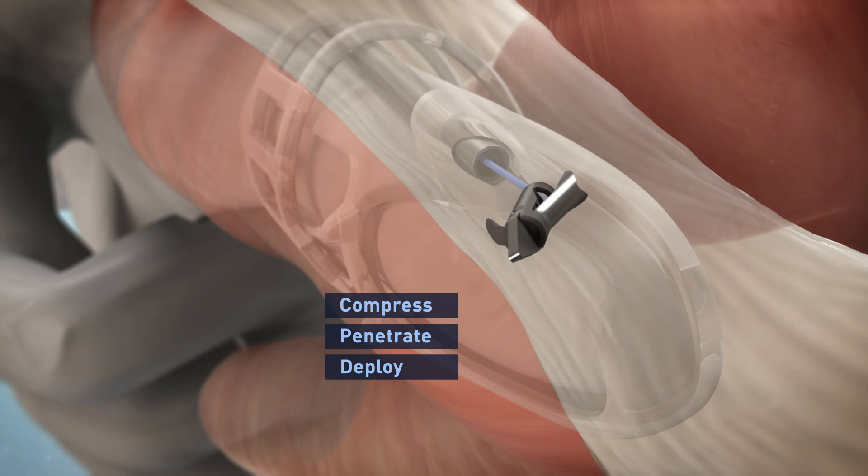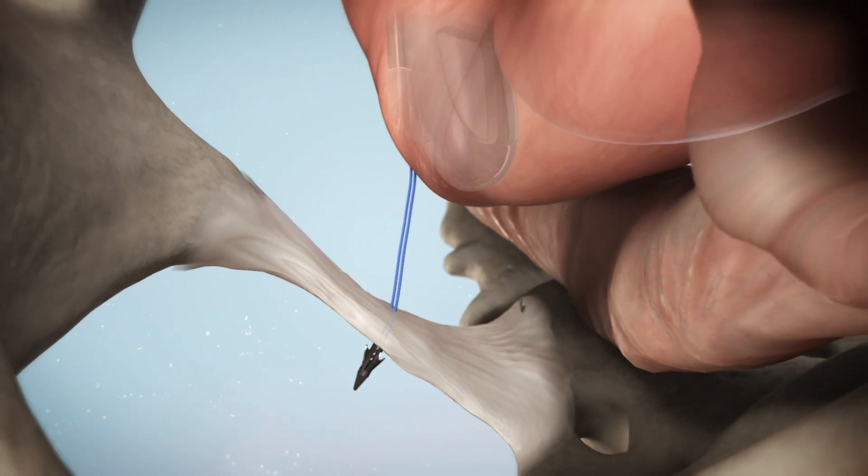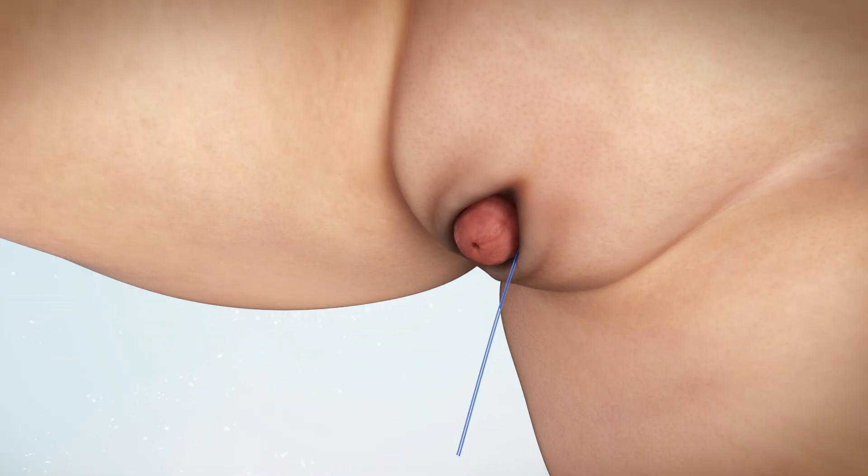Perform a clean deployment of the anchor into the posterior aspect of the SSL. Some surgeons depress the trigger two to three times to propel the anchor forward through the ligament. Repeat the same procedure on the contralateral side using the remaining finger guide. Some surgeons may opt to utilize a unilateral approach, which is also common. At this time, perform a rectal exam to confirm proper anchor placement.